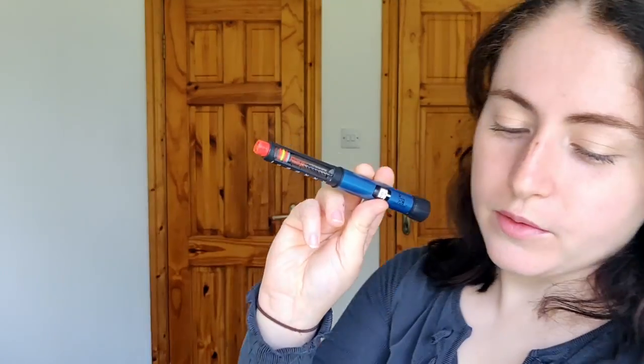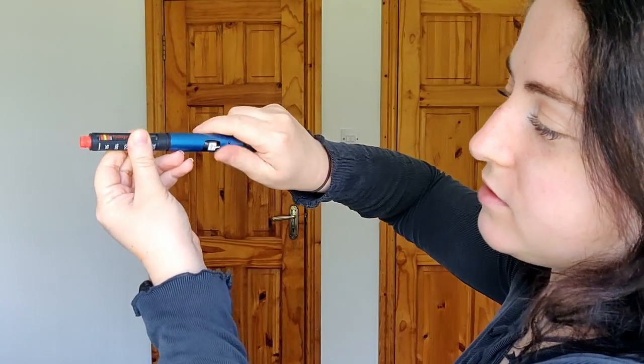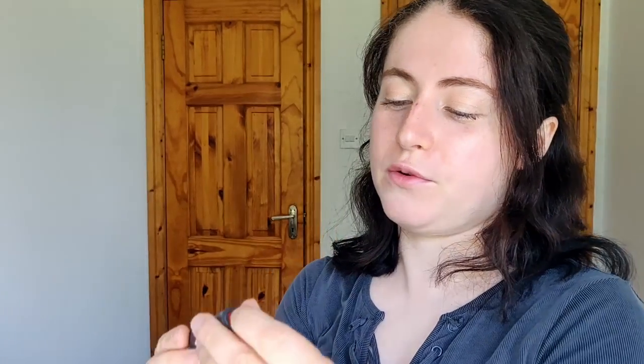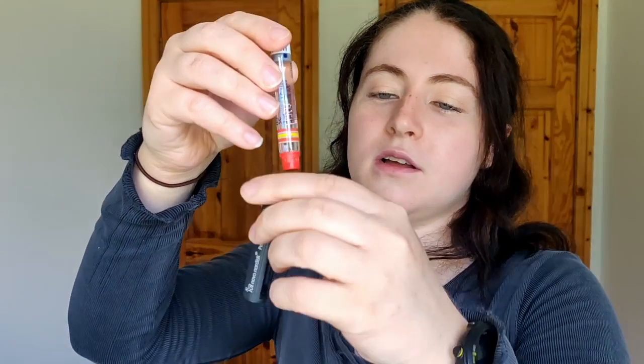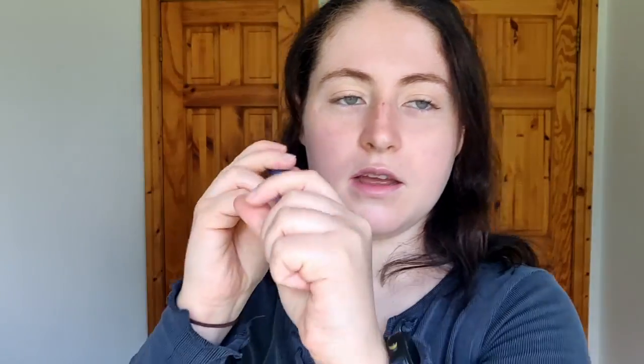So while we're here, let's change the vial of Fiasp. Simply twist it off — this is the plunger part. Remember when I did the Demi, we had to wind that down, but now it literally just falls back itself for any pen after the four. Take out the old Fiasp vial, put in the new Fiasp vial, screw the pen back together, put the lid on, and it's ready to go.